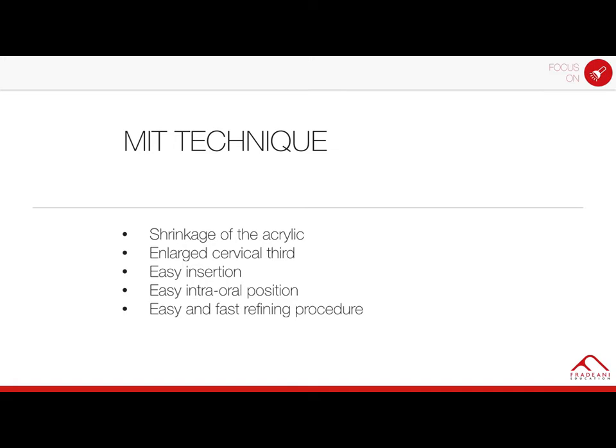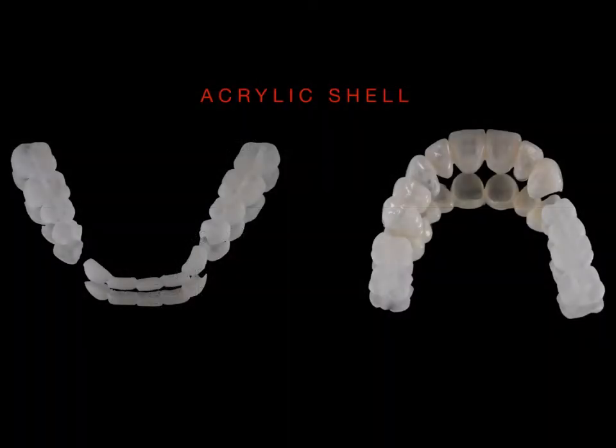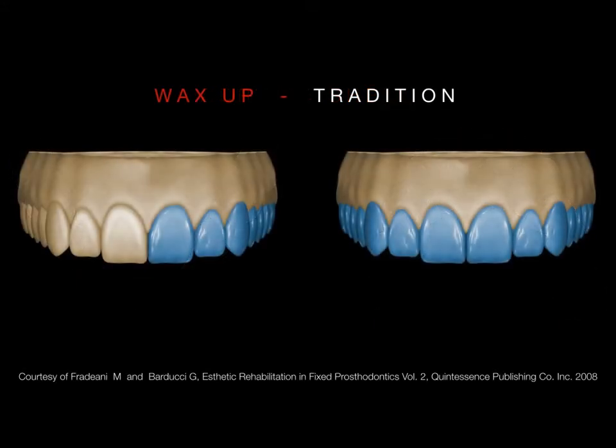fast relining procedure. So what we need to know is that the acrylic shell is in some way not easy to really overcome the problem of fitting and the precision inherent in the traditional indirect technique. To obtain a shell that, encountering no hindrances to its insertion, could be guided into the correct position directly by the occlusion itself. An ideal acrylic resin shell insertion is of course fundamental in order to reline in the correct position, equally valid whether the provisional restoration is fabricated before or after the teeth are prepared.